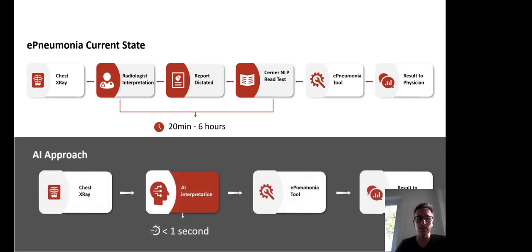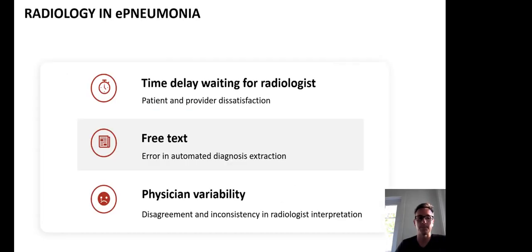So we've inserted an AI model, a multimodal fusion model, similar to the approach I talked about earlier, where, this is actually an early fusion approach, we're taking EHR data that he's already developed and the pixel data together and creating a model that can make a decision right away without having to wait for interpretation. And so the advantage here at the point of care, as opposed to deploying this in the radiologist's room, is that they don't have to wait for a radiologist.